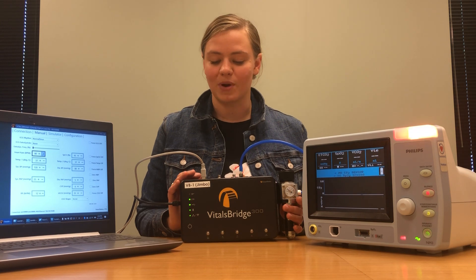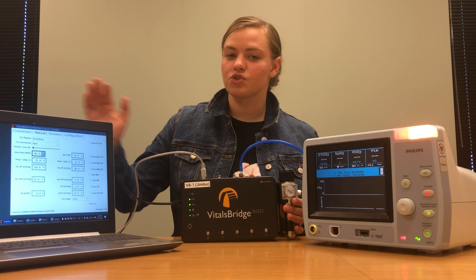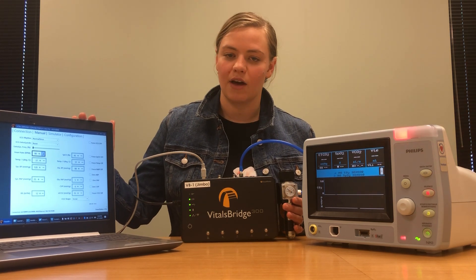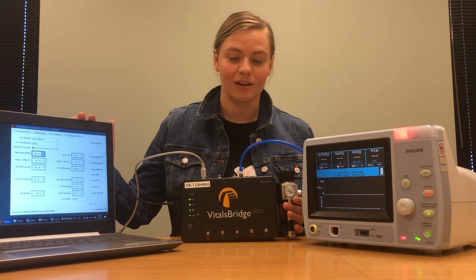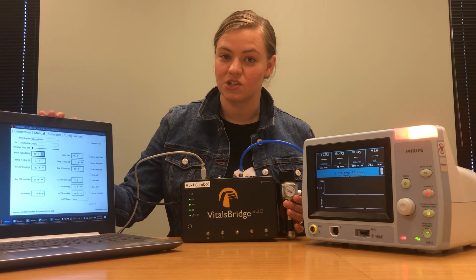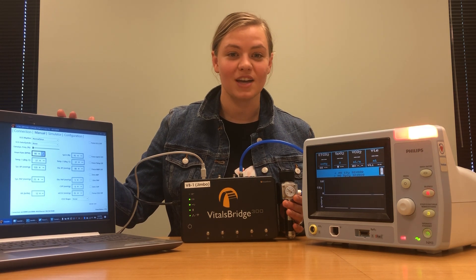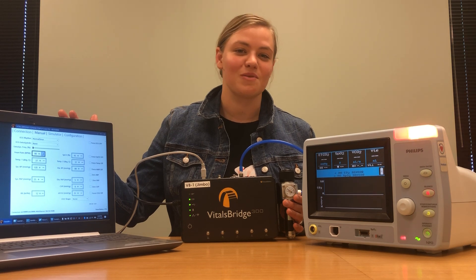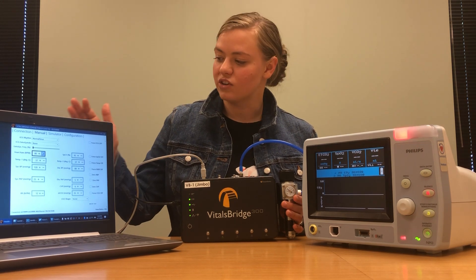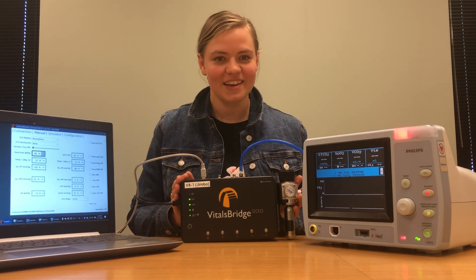You can also operate the VitalsBridge from an Android mobile device or tablet. To control the VitalsBridge on your laptop or other electronic device, you're going to need to download the VitalsBridge connector software. The VitalsBridge connector software can be found on vitalsbridge.com/downloads for laptops, or if you're using a mobile device or tablet, you can download it from the Google Play Store. Once you have your VitalsBridge connected and your software up and running, we're ready to start connecting.